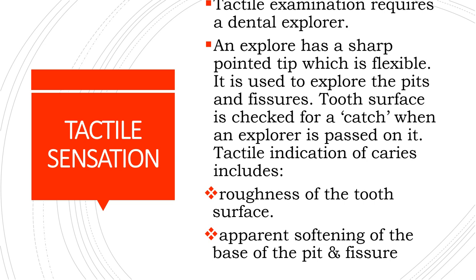Tactile sensation. Now, tactile means to touch. So, tactile examination requires a dental explorer. The explorer, we all know, has a sharp pointed tip which is flexible. This is used to explore the pits and fissures. The tooth surface is checked for a catch when the explorer is passed on it.